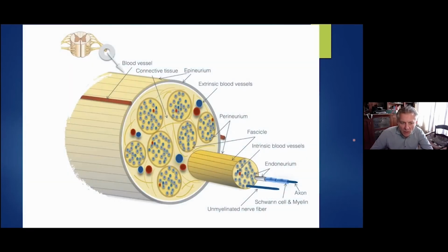So what are our possibilities? Well, we would like to put our needle perineurally, outside the epineurium. But accidentally, we can pass the epineurium and inject in the stromal tissue, probably without consequences. If you advance your needle accidentally in a vessel, you can cause a bleeding with compression, but you can also cause an occlusion with ischemia. And if you put your needle farther and you perforate the perineurium, you are intrafascicular. With the tough perineurium, you will have a severe compression in the fascicle with probably severe lesions.